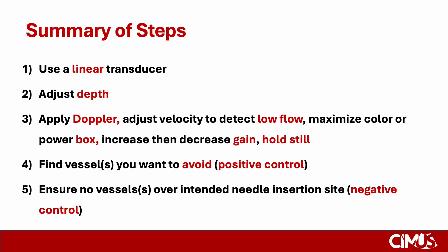Let's review the step-by-step process we just covered. First, using a linear array transducer, adjust the depth to optimize your image in the center of your screen. Apply Doppler. Adjust your velocity to detect low-flow vessels. Maximize the color or power box to capture all of the structures that may contain vessels, and increase gain until there is significant aliasing, then dial it down to still pick up flow while reducing the surrounding aliasing. Hold still to prevent movement artifact. These steps will be performed in two sequences: first by finding vessels you want to avoid with positive control, and then over the site you intend to insert your needle to confirm the absence of vessels with negative control. Once you have performed these steps, you are ready to perform your procedure.